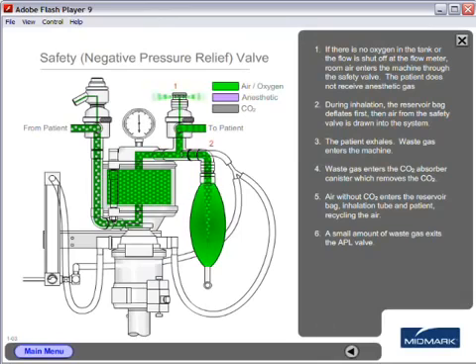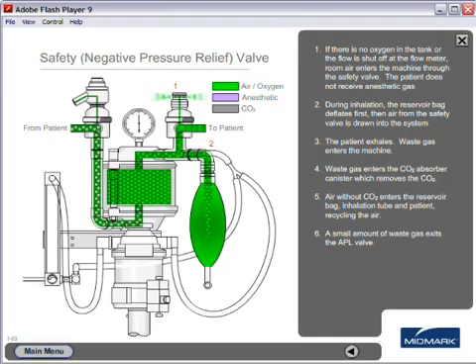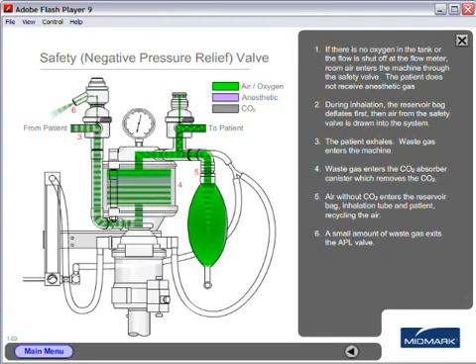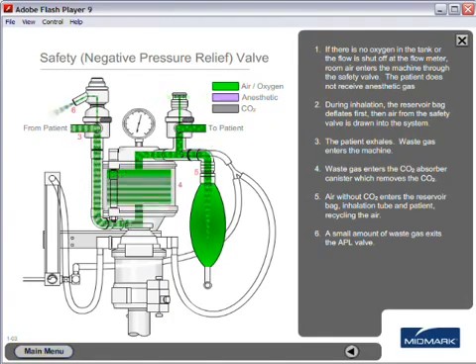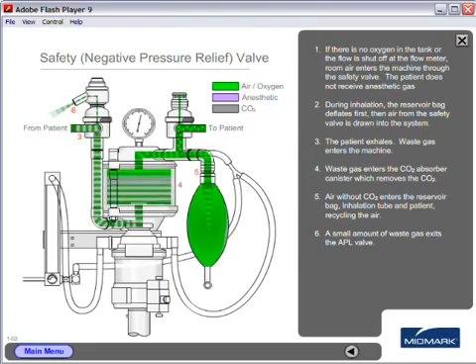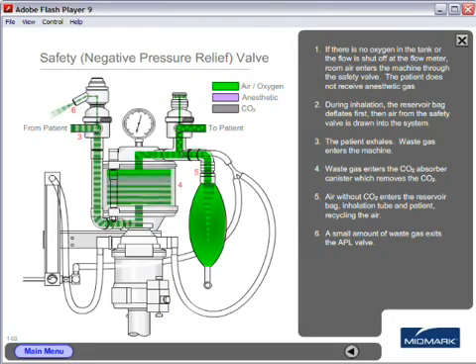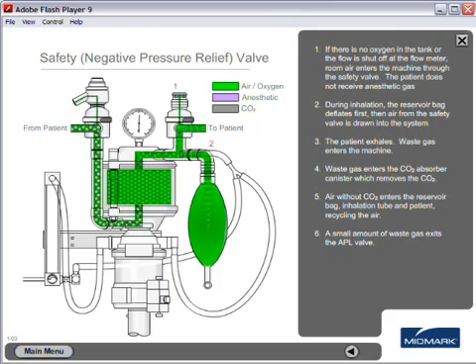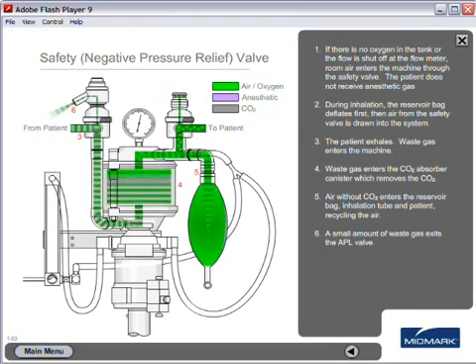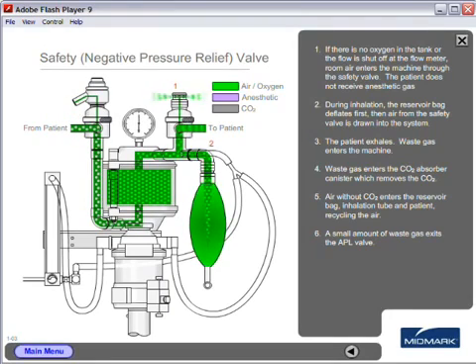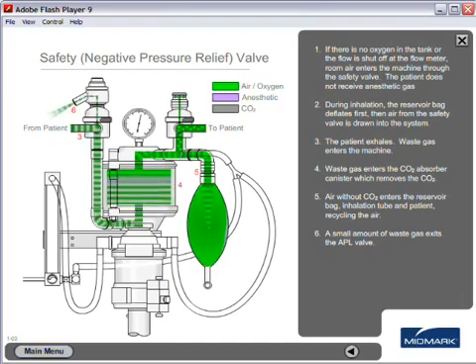Safety valve. Number one, if there is no oxygen in the tank or the flow is shut off at the flow meter, room air enters the machine through the safety valve. The patient does not receive anesthetic gas. Number two, during inhalation, the reservoir bag deflates first, then the air from the safety valve is drawn into the system.